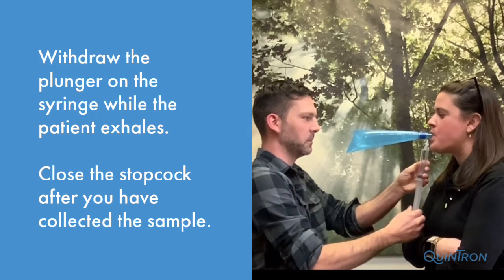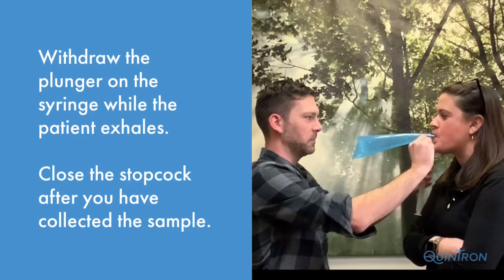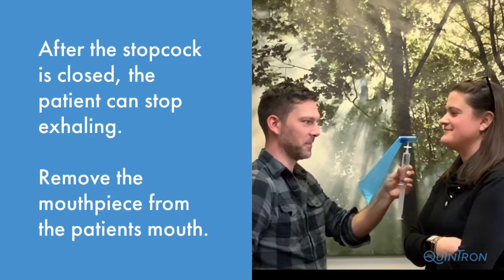Withdraw the syringe while the patient exhales and close the stopcock. After the stopcock is closed, the patient can stop exhaling.